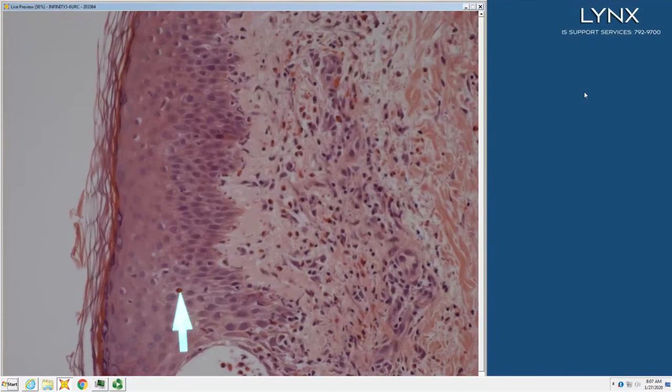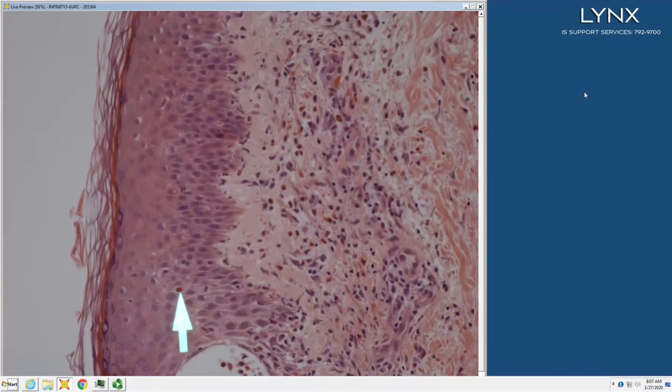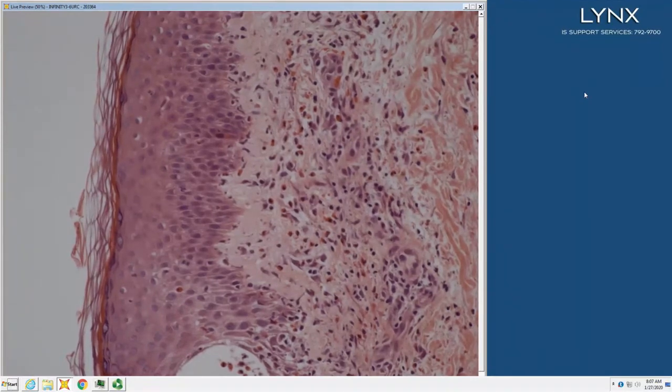How do you feel when you see spongiosis with eosinophils? Happy. Happy standing for herpes gestationis. That too. Arthropod, allergy, pemphigoid, pemphigus, incontinentia pigmenti, and this is another pemphigoid at a spongiotic phase, but spongiosis with eos. So your happy differential, and then erythema toxicum.